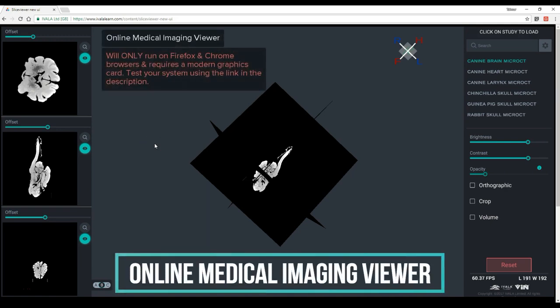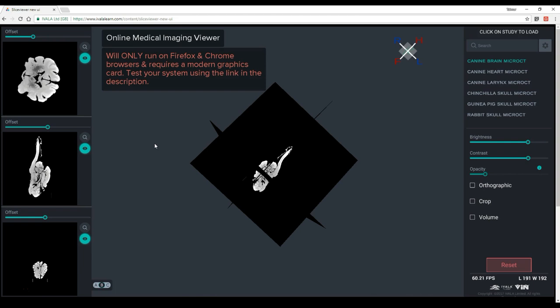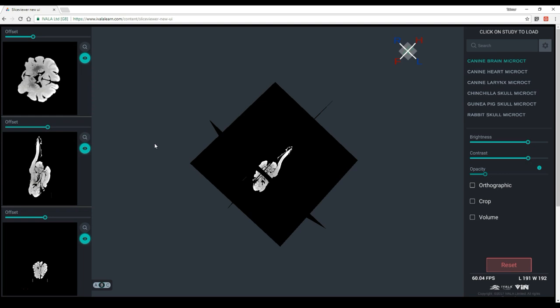So we're really happy to be making available for you today a new and completely different project to our traditional projects. And here at IVALA we've been using some really nice CT and MRI imaging data to help us with construction of models and general anatomical work. And we really wanted to make this imaging data available to you so that you can use it as well, because it holds such a lot of information in and of itself.